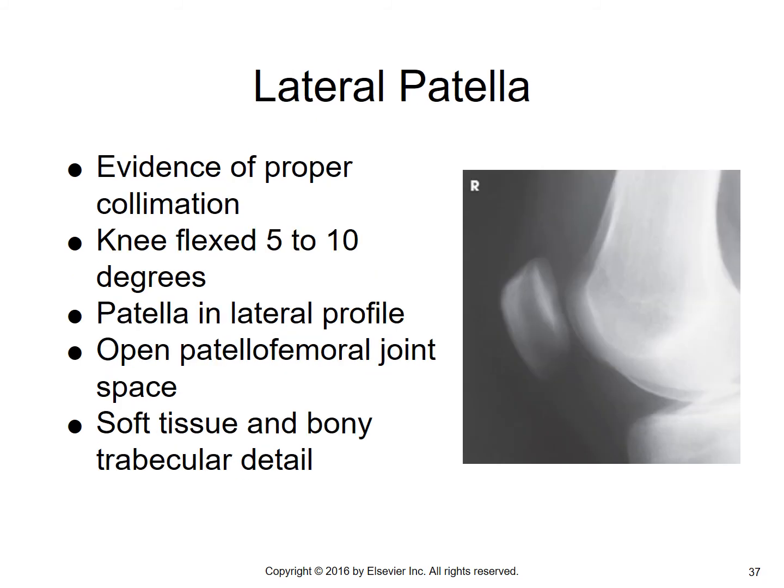For the lateral of the patella, evidence of proper collimation again. Knee is flexed only 5 to 10 degrees versus that 20 to 30 for the lateral of the knee. Patella is in lateral profile. Open patellofemoral joint space. Soft tissue and bony trabecular detail are seen.